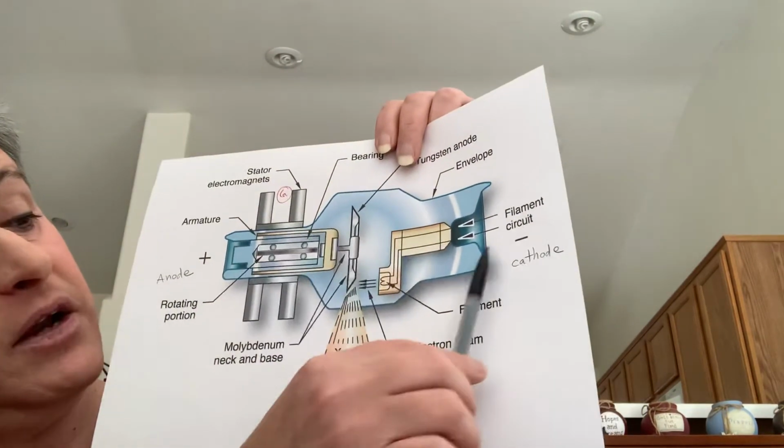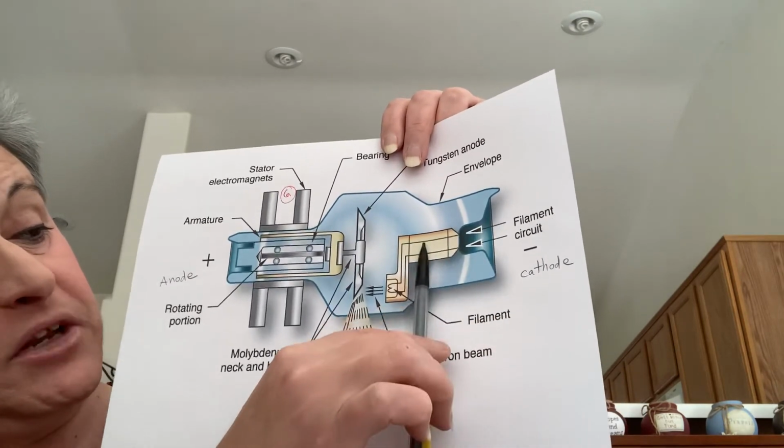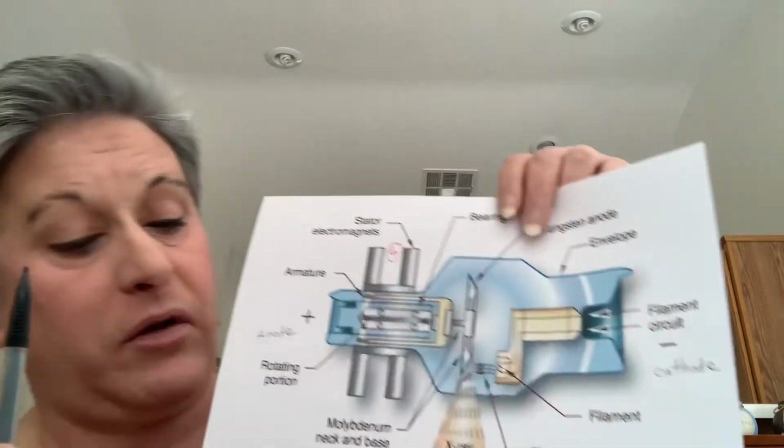On the cathode end of the X-ray tube, the electricity comes in from the filament circuit. Over here, the filament circuit comes in on this side, and the electrons reach the focusing cup.